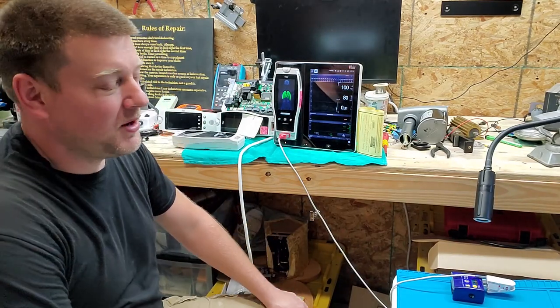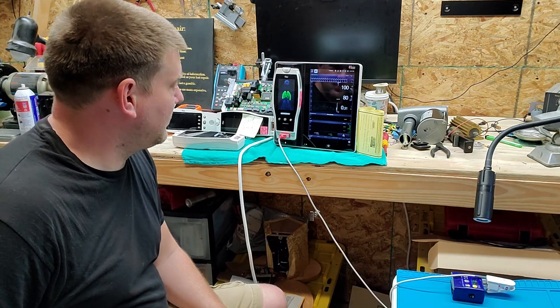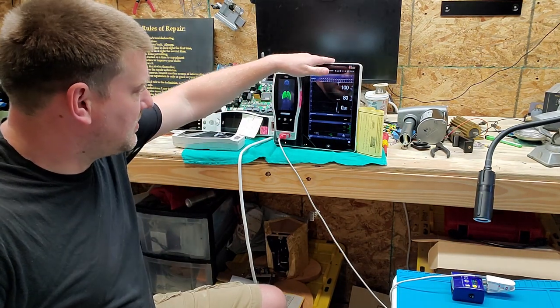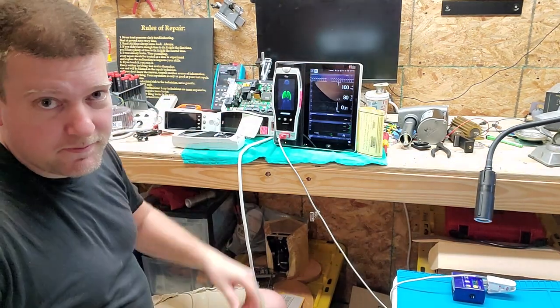Hey guys, welcome back to BetterBioMed. Today you can see I'm goofing around with the Masimo system — this is the Root, which is the base, and these are the Radical 7s. You can see there are a couple of different versions of that.